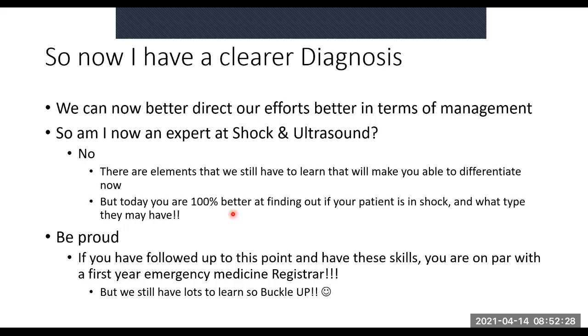Just like I tell you guys, just as long as you know the basics and you know how to navigate it, you don't have to know every single little nitty-gritty because you're not an ultrasonographer. At the end of the day, you work in an emergency department. You're trying to make sure that you know as much as you can to be able to get your patient going in the right place.